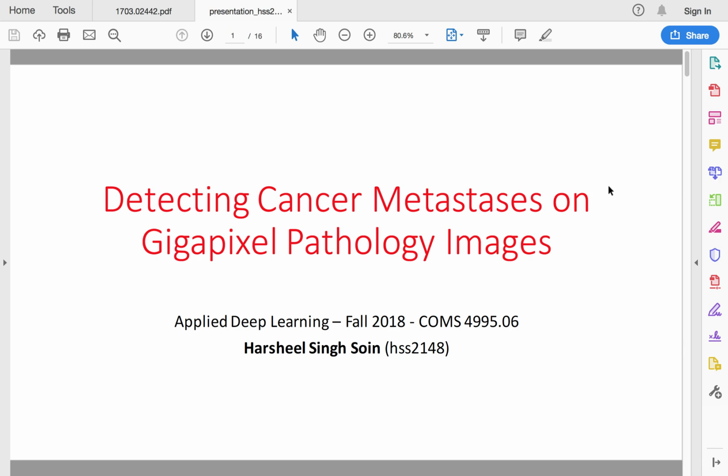And if you think about building this model, it is essentially a binary classifier that needs to be built to predict whether or not a slide contains tumor. But in practice, it is more meaningful to extract patches from an entire whole slide image, make predictions on each of those patches, and generate a heat map, which can then be overlaid on top of the actual whole slide image to highlight the regions of tumor.